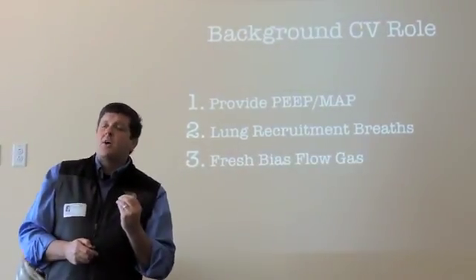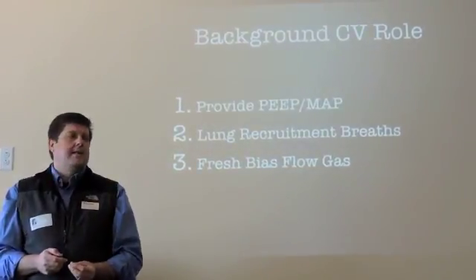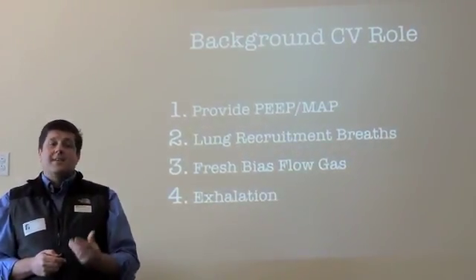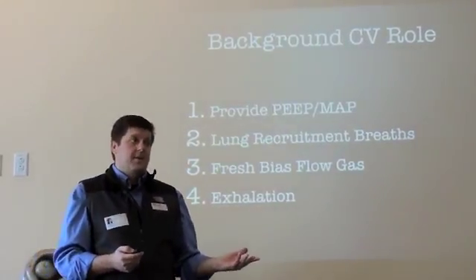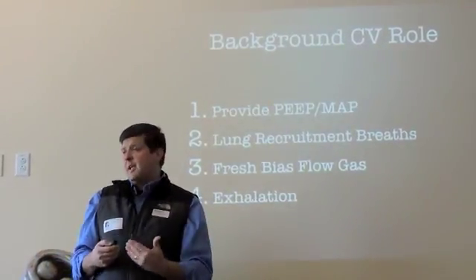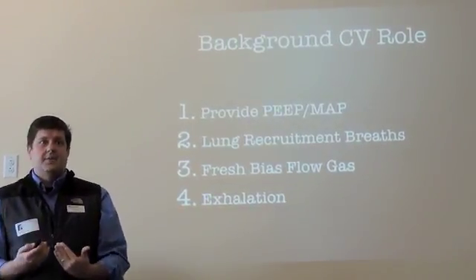The conventional ventilator also gives gas flow for the baby to breathe spontaneously. We definitely need that, we want that. And all the exhaled gas actually goes out the conventional. So the conventional does a lot of stuff here, okay? Appreciate the power and how much support the conventional ventilator actually gives.